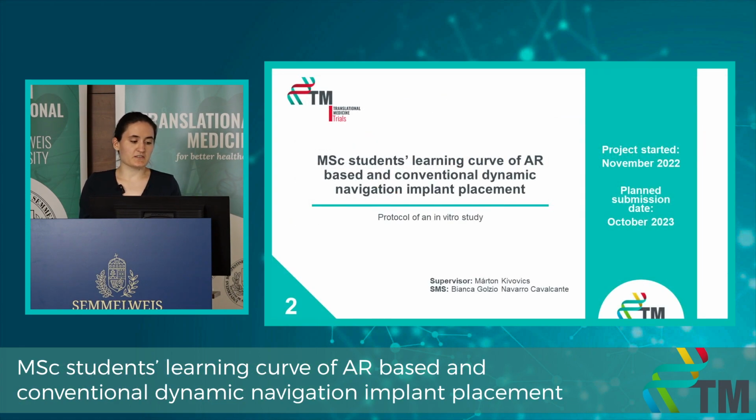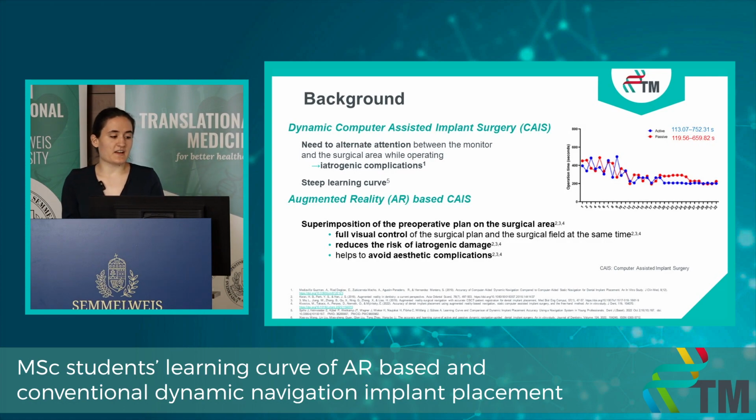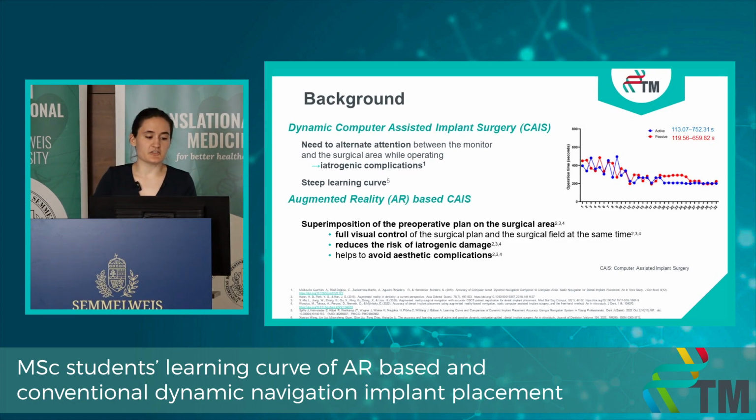My second project is about MSc students' learning curve of augmented reality-based navigation. We would like to compare it to the dynamic navigation. As you heard before, AR has this advantage over it, that it superimposes the plan on the surgical area.